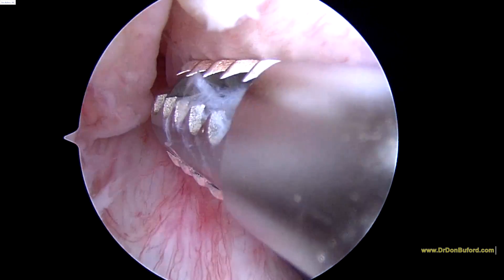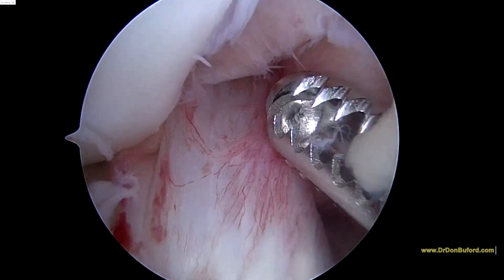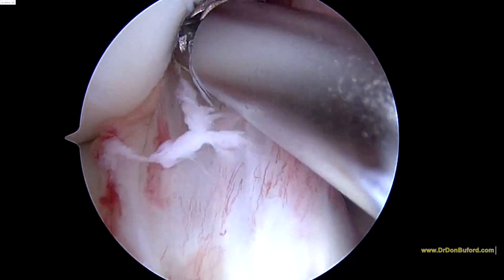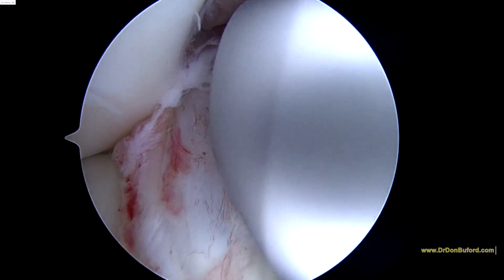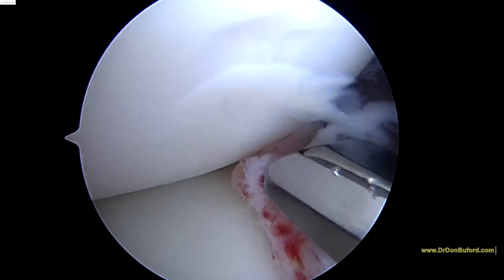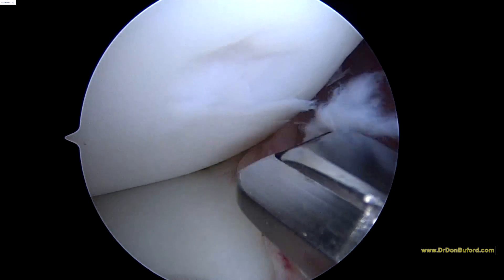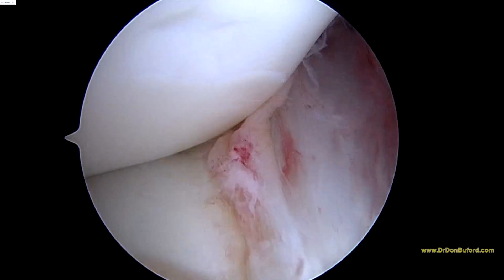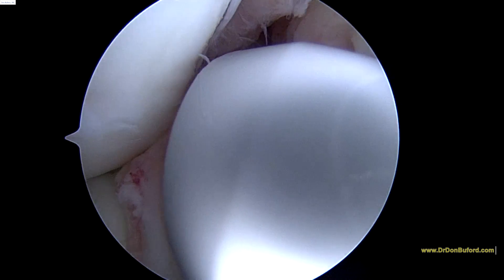That doesn't look like it's where any loose body would have come from, and it's off of the weight bearing aspect. The tip of that instrument there is only about two and a half millimeters across, just to give you an idea. Things are magnified about 40 times on the screen.